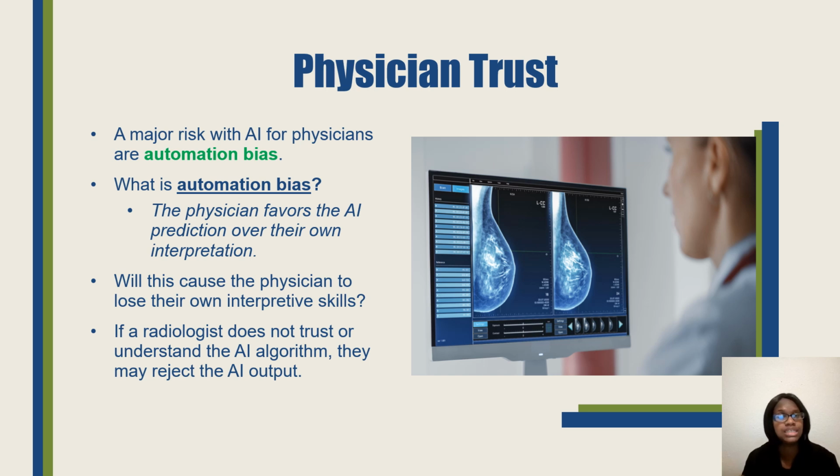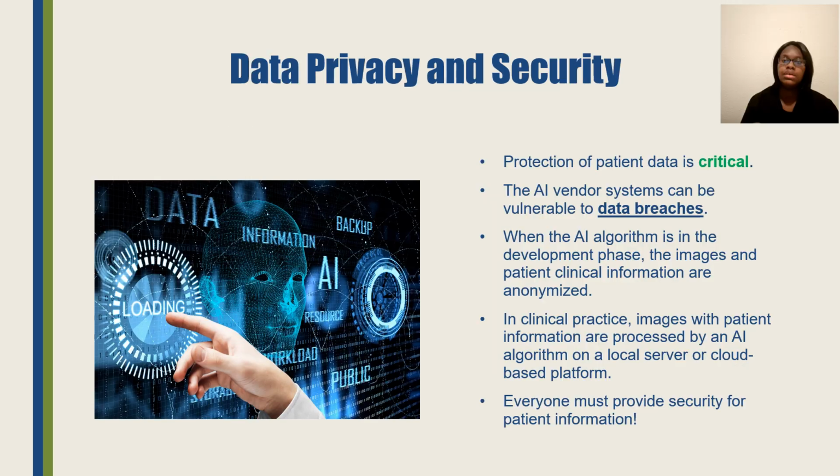Okay, you have your physician trust. Will this cause the physician to lose their own skills? Are they relying on AI too much to where they're not relying on their own skills? You have the concern for data breaches. So, will the patient's information be protected?